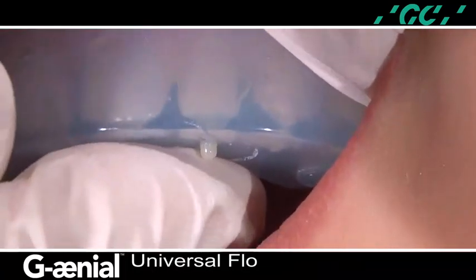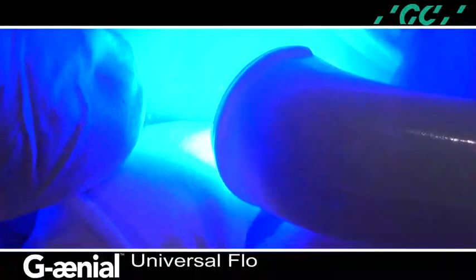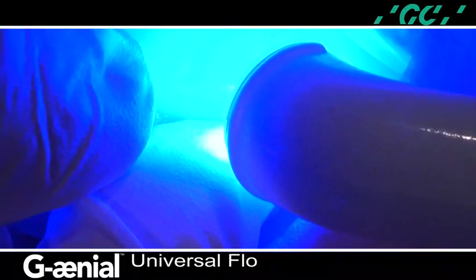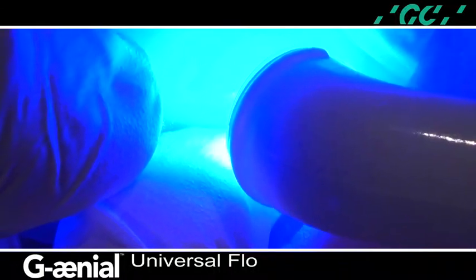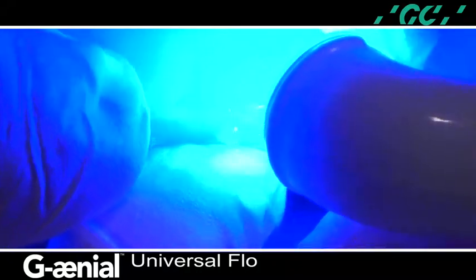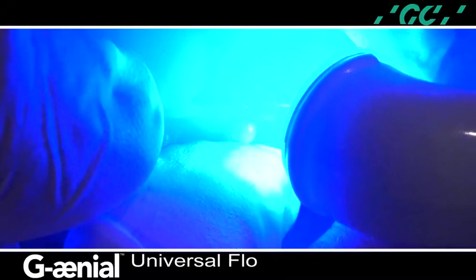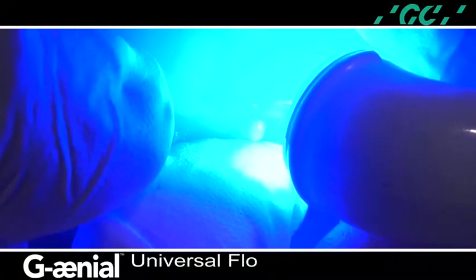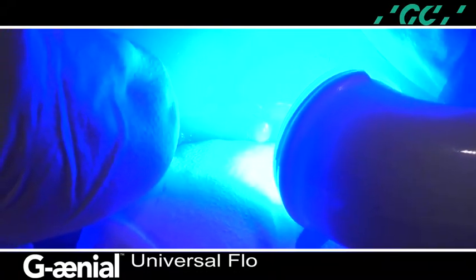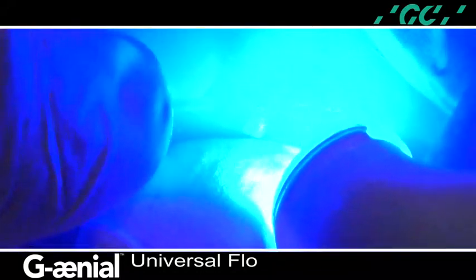Continue to apply firm pressure and light cure from the incisal and facial aspect for 40 seconds. The clear polyvinyl siloxane material can be used as a matrix to cure composite resin because these materials have no opaque fillers. Although no studies report a decrease in polymerization, it is recommended to use a high-intensity curing light and to post-cure without the matrix in place.